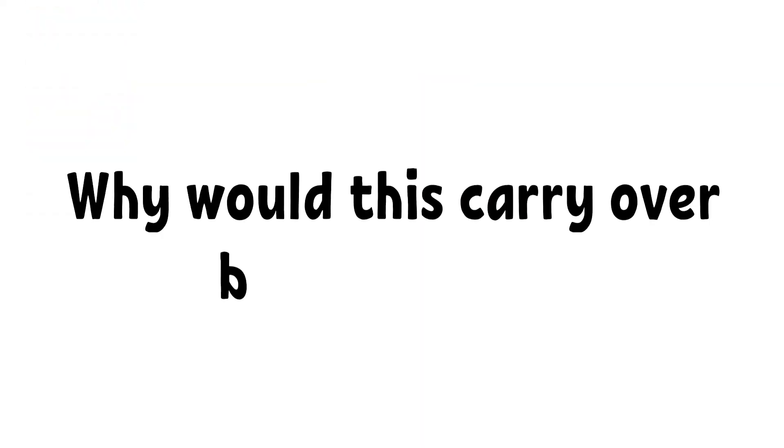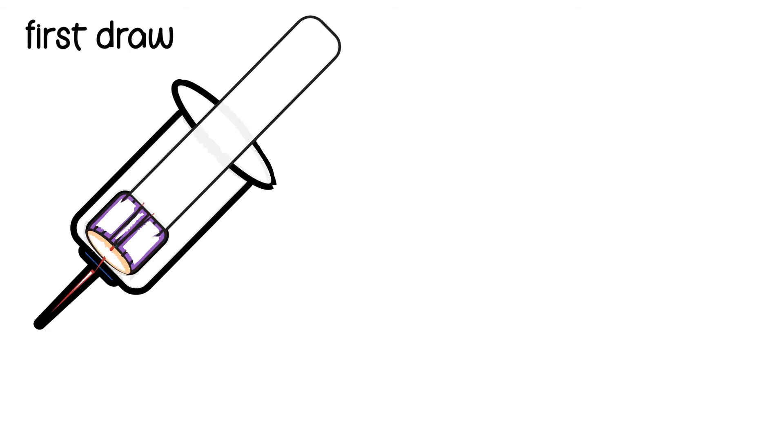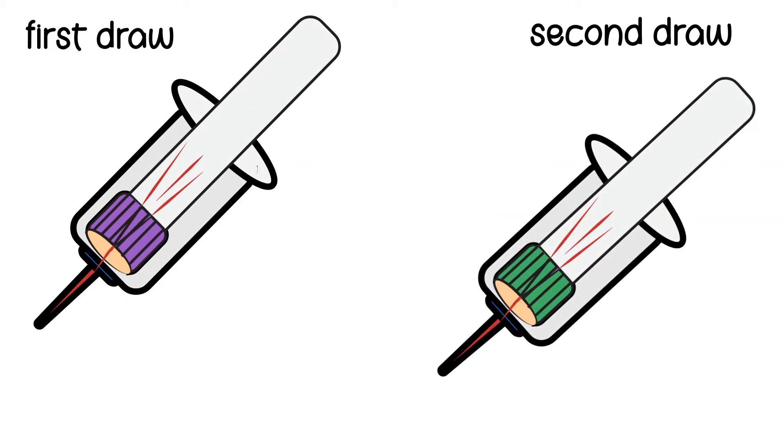Why would this carryover be a problem? If you draw purple top tubes before your green top tubes, the carryover from purple tubes can cause falsely high potassiums.